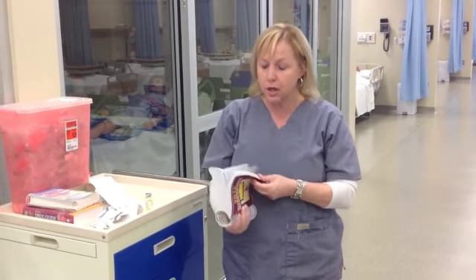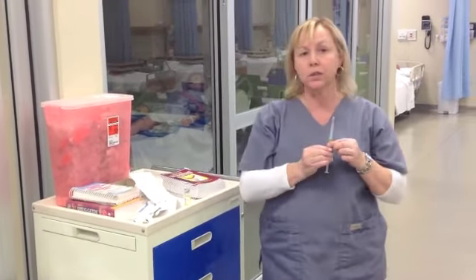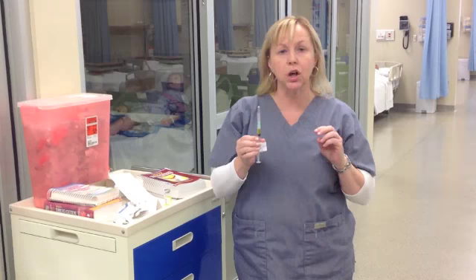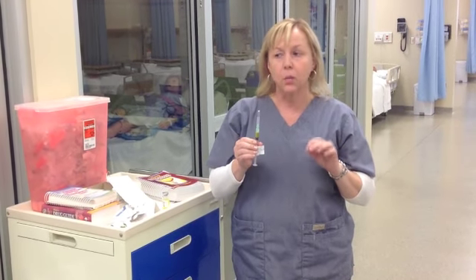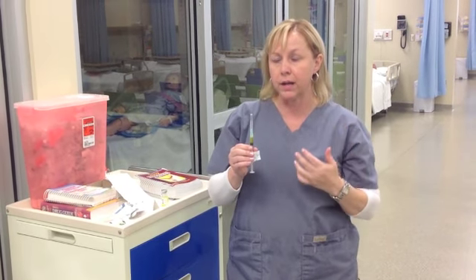So let's say I've looked up my Practi powder in here, and for this particular medication, I don't have to dilute it, which means I can give it straight like it is, and I need to push it over at least 1 minute. So when I get into the patient's room, I need to already have calculated in my mind how fast I'm going to push that.